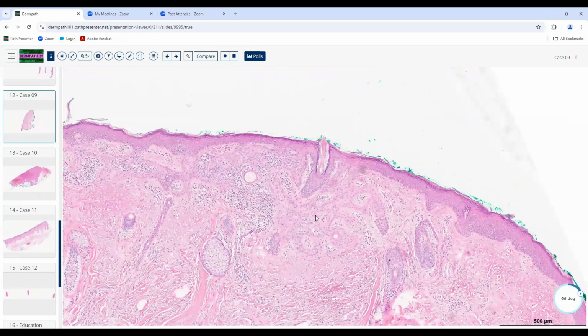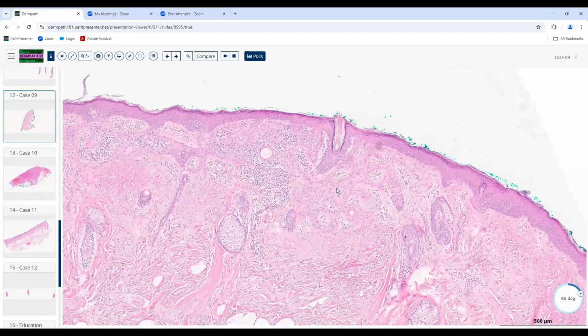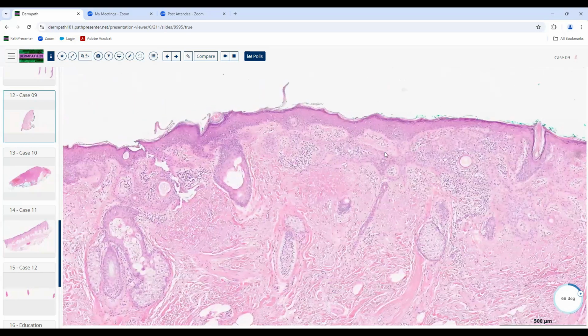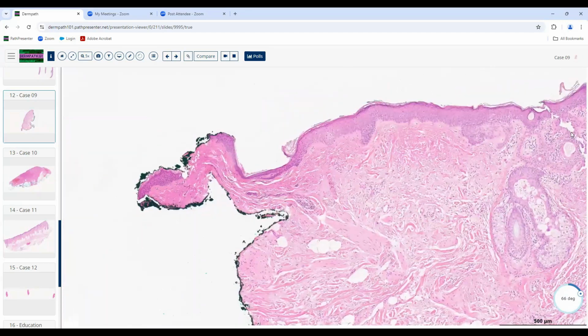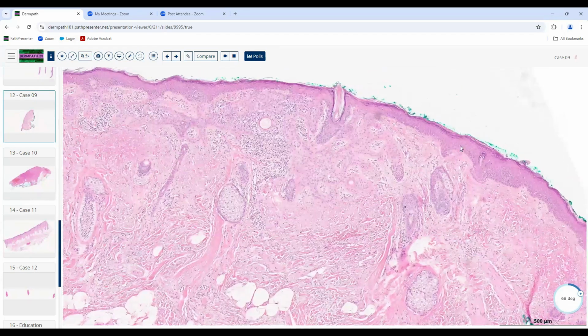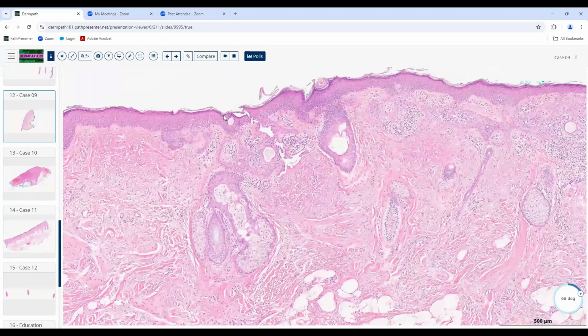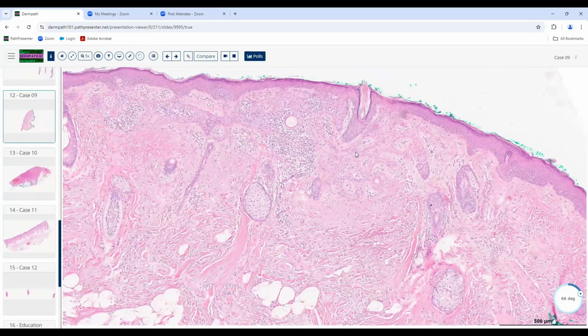Now, it's probably not the world's best name. And today, if we were naming this, we probably would call it something like a mantelloma, if you will. In fact, some people have written articles where they call these things mantellomas. They're basically a little neoplasm of the mantle zone of the follicle, and it's producing this little primitive follicular structure here. And the key to it is that it's oriented in a horizontal fashion over a relatively broad front. That's the clue to this. It's always in this plate-like fashion like you see here. So this is classic for this. It's a little bit esoteric, but they could ask you this on the board examination. It's fair game. You should know what it looks like.